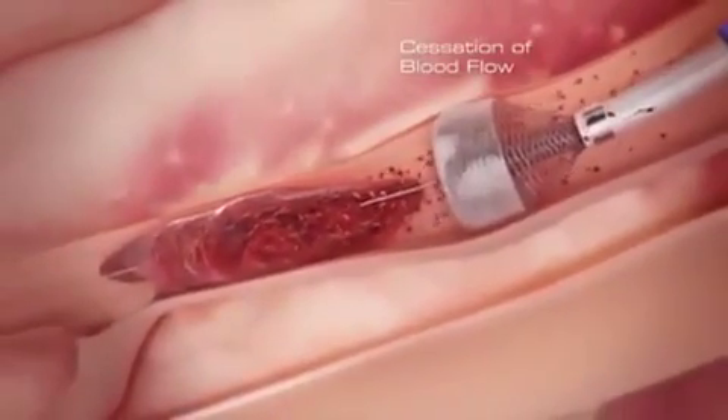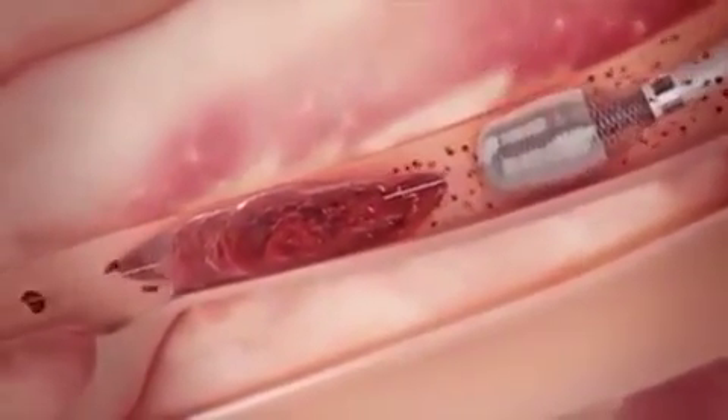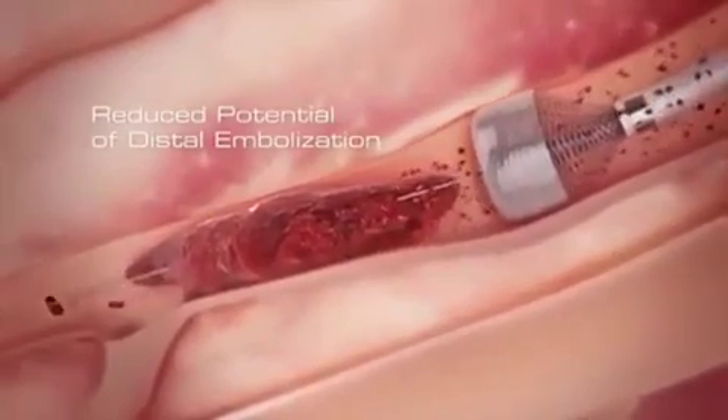Cessation of blood flow prevents clot fragments from traveling downstream, greatly reducing the potential for distal embolization.